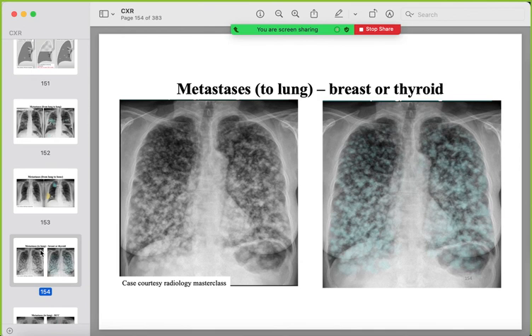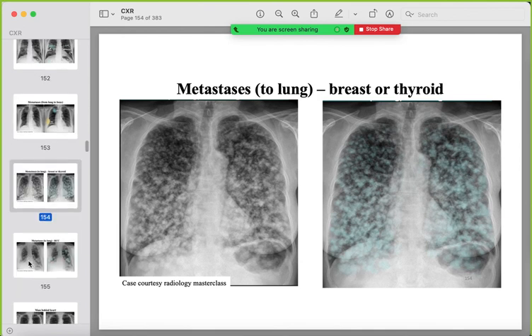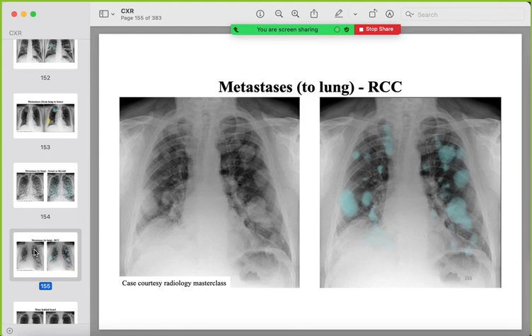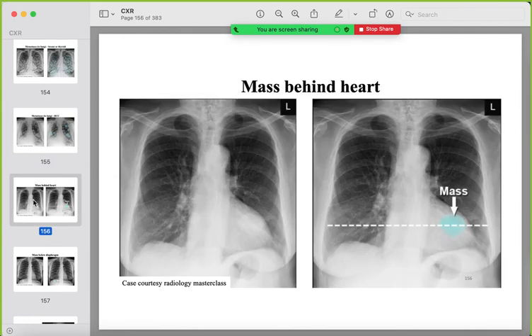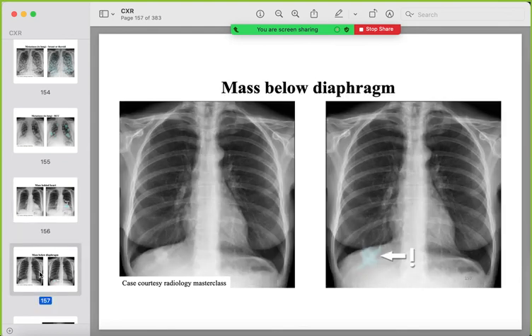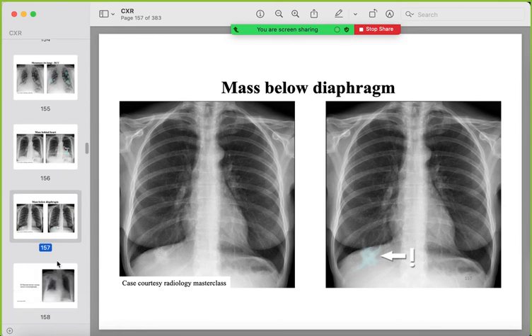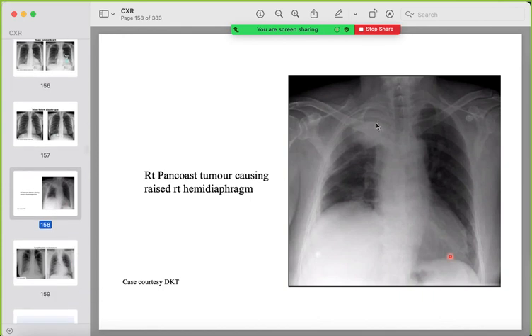Miliary metastases from breast or thyroid. Cannon ball metastases from renal cell carcinoma. Tricky locations: a rounded mass behind the heart, and a mass under the diaphragm in the right lower lobe or liver. A right apical mass causing elevation of the right diaphragm indicates invasion of the right phrenic nerve — be aware of this consequence.